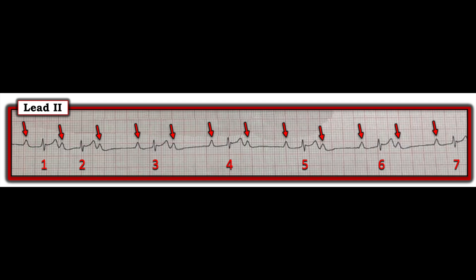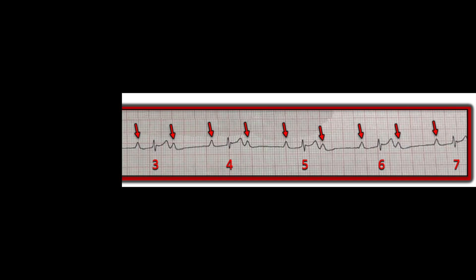How about the ventricular rhythm — is it regular throughout? It's fairly regular for most of the rhythm except in the beginning. The rate: what is the ventricular rate? Let's forget about the first two beats for a moment. How many large boxes in the R-to-R interval? One, two, three, four, five — a little bit more than six boxes. The rate is a little bit under 50 beats per minute.